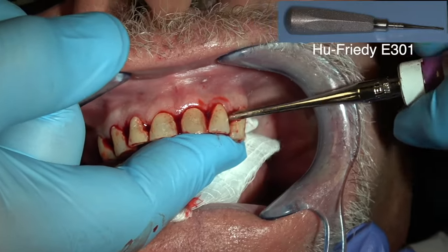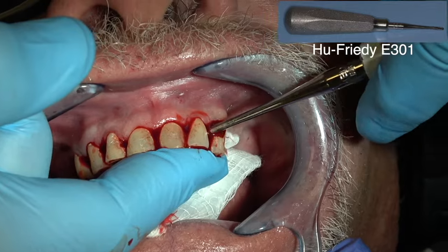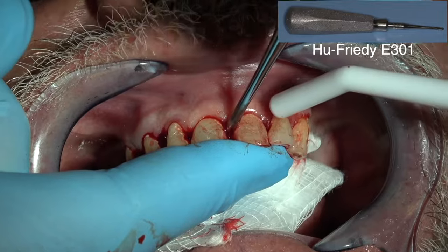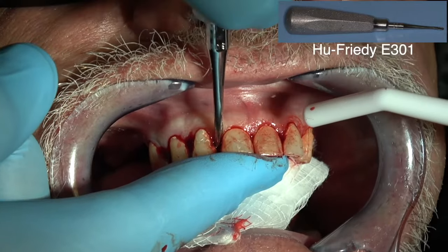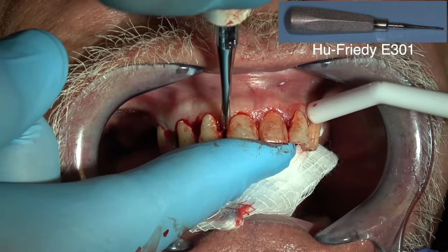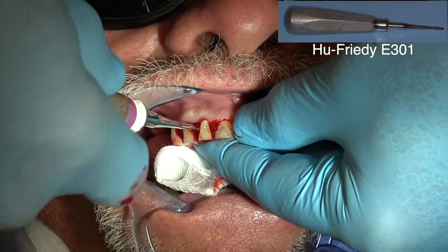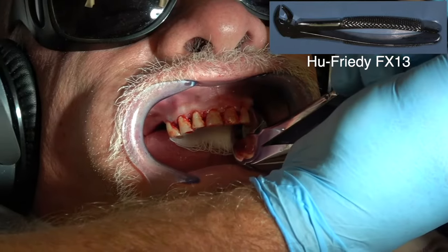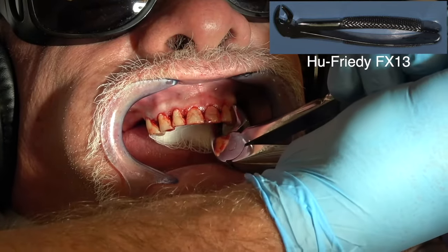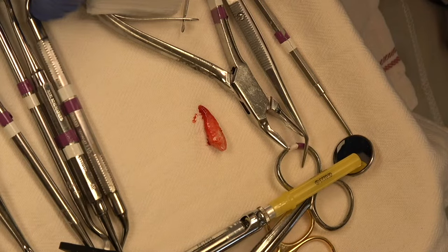I'll take some time to elevate them — just let the blood in the periodontal ligament space work for you. I'm just unscrewing those teeth. This is a nice instrument for single-rooted teeth. See, they're just coming straight out of the socket now.